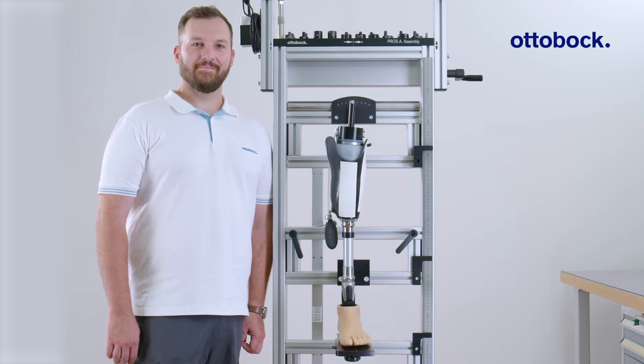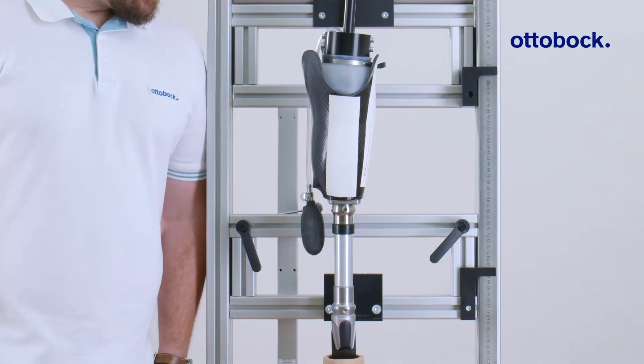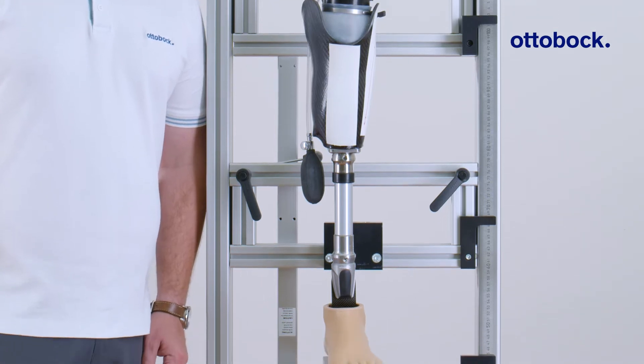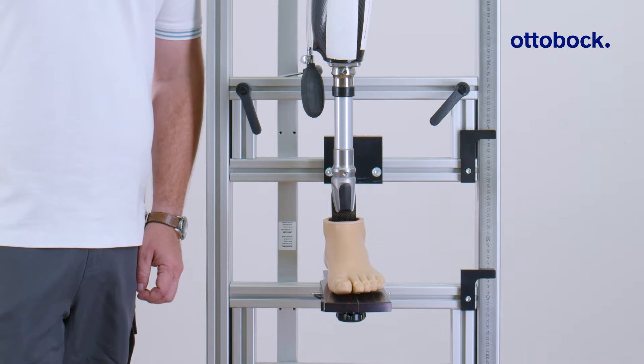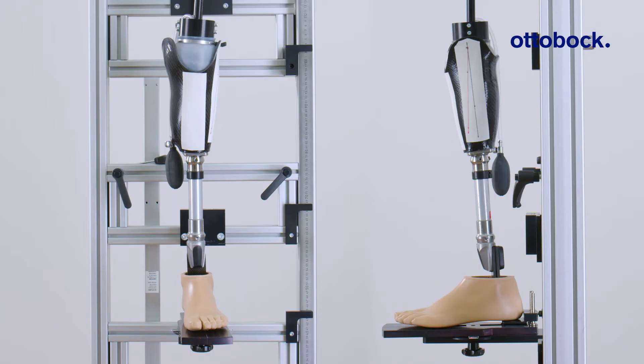This video shows Ottobock's general alignment recommendation for transtibial prostheses, which is applicable for many Ottobock feet such as Taleo or Evanto. The PROSA assembly shown here is used for optimizing the alignment. Note that some feet have a different alignment recommendation, therefore always refer to the alignment recommendation of the respective foot.